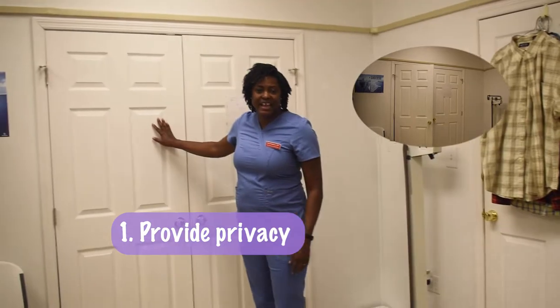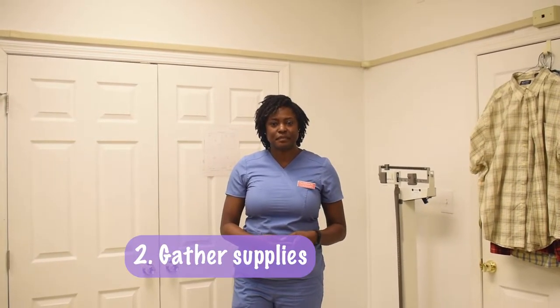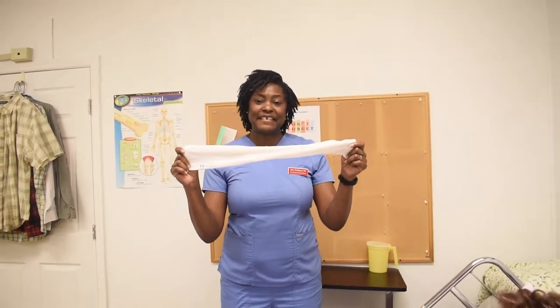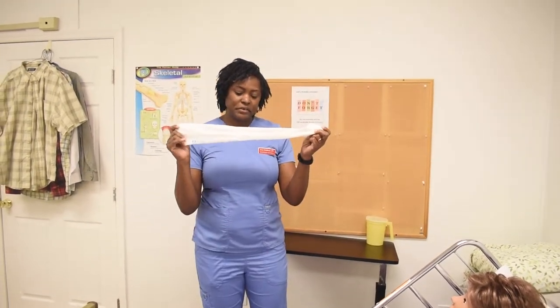I first ensure that she has her privacy. If it was a curtain I would pull it, but it's a door and it's closed. Now I would gather my supplies. For this skill we only need the elastic stocking. In real life though we would also use gloves, but for our training we're only using the stocking.